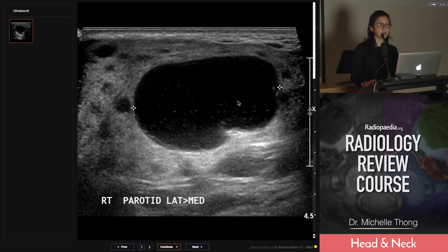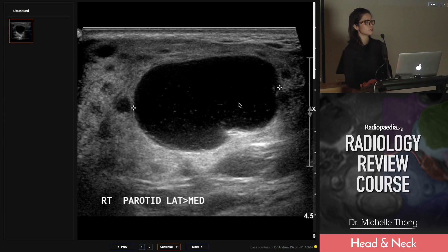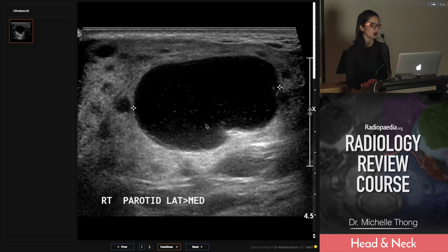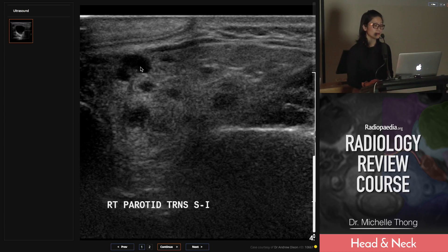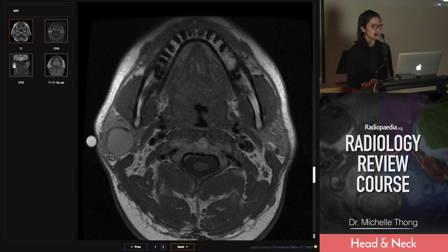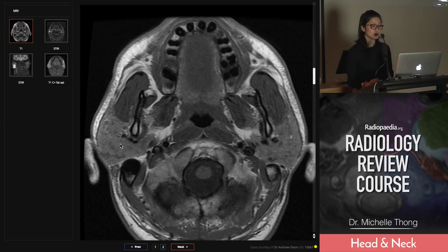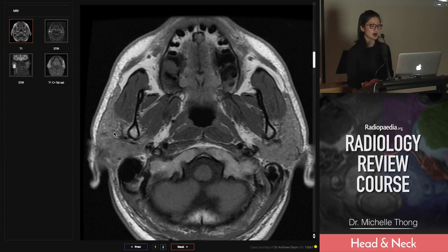Ultrasound is very useful in the parotid — it's very accessible, especially the superficial lobe. In this one, there's a hypoechoic lesion, anechoic anteriorly with little internal debris, and posterior acoustic enhancement — it's a cystic lesion. But look around the parotid next to it: all these little dots — that's too many for a single image. The background parotid is abnormal; some could be nodes, some are complex cystic, some indeterminate, but they're very small. This is a proteinaceous cyst in the parotid on a background of abnormal parotid glands bilaterally.